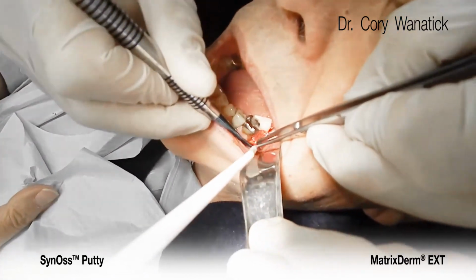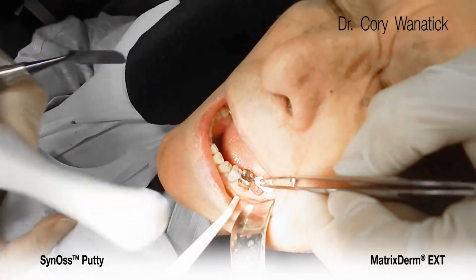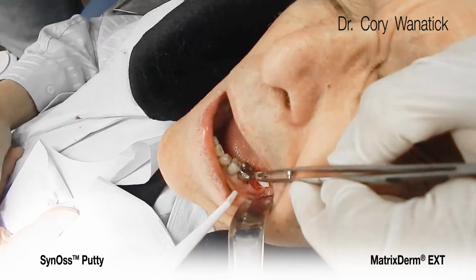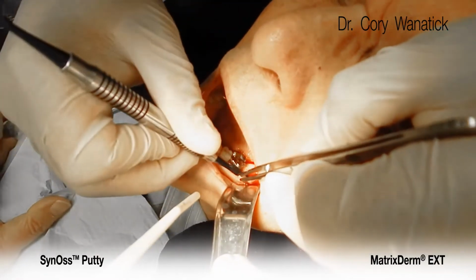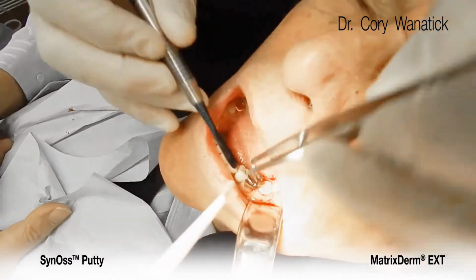Thank you. We'll take the membrane, bring it over to the facial surface, lightly pack that underneath our pouch, and we're ready for suturing. Stay open, please.